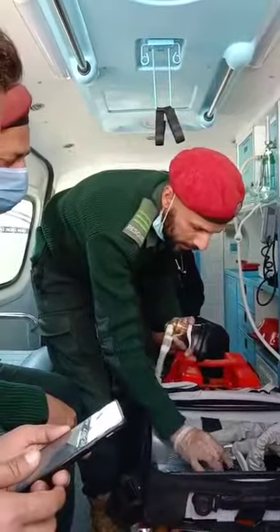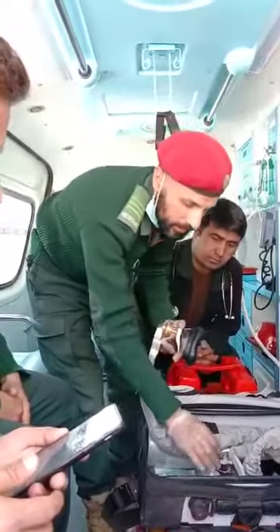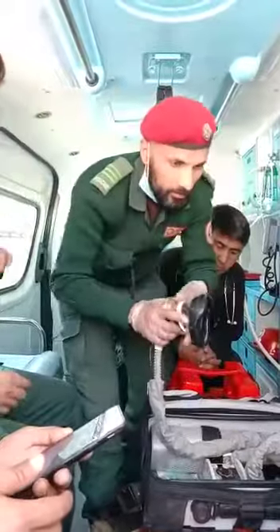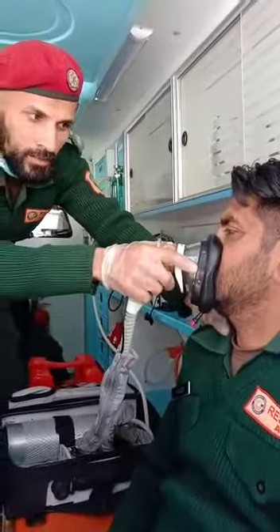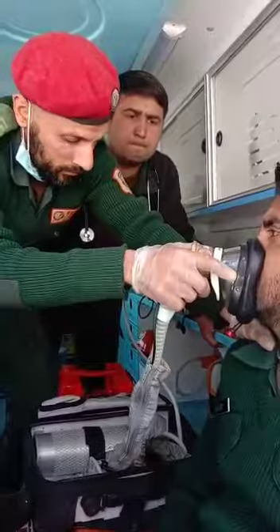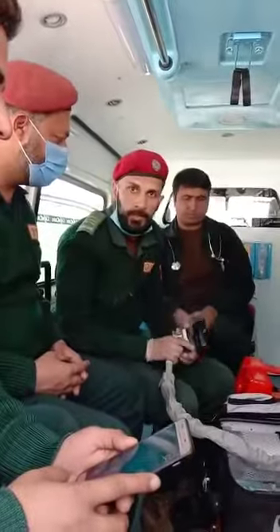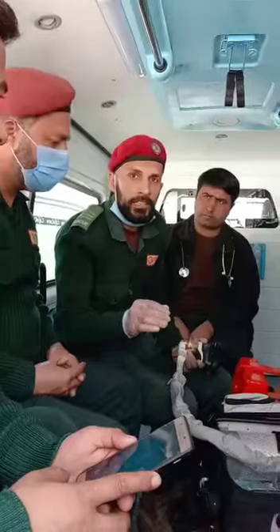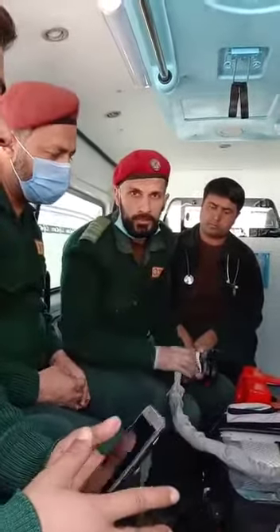Here you can see the levels: 300, 500, 600, 800, and so on. His required volume is 455, so put the ventilation oxygen mask on his face — now he is getting oxygen according to his body weight. This is proper life-saving equipment that can provide full ventilation to patients suffering from very severe situations.